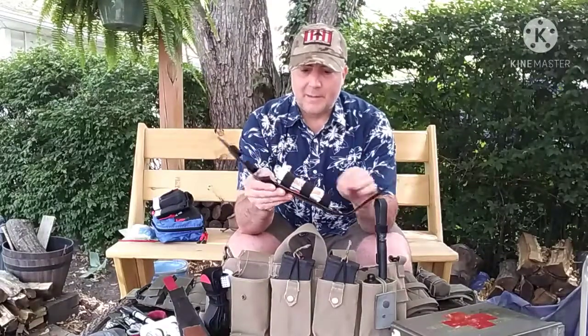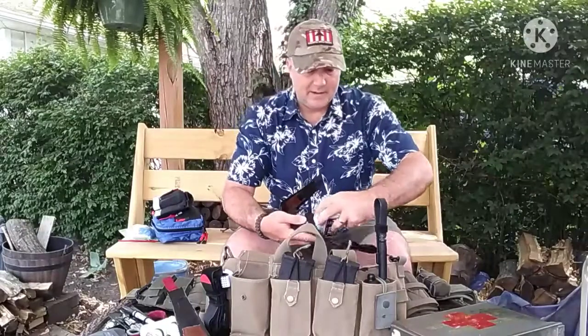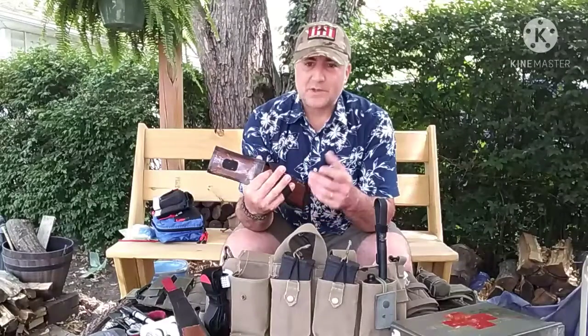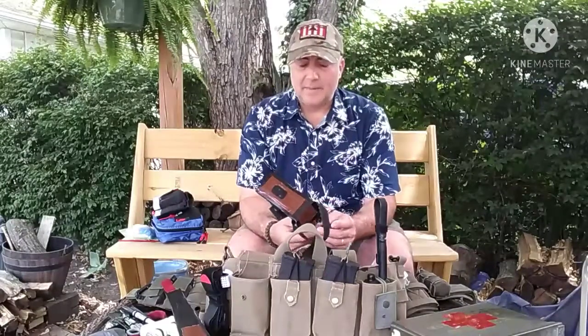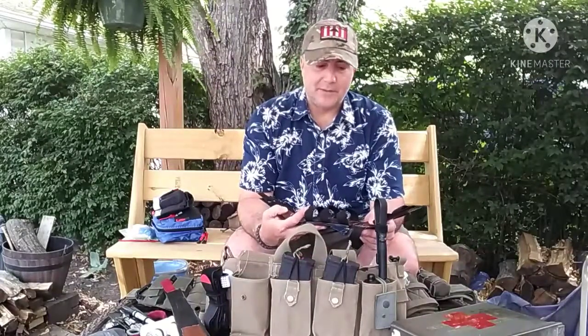But another thing I like about these a lot is you pop everything out of here. Again, there's not a lot in there. It's just the basics. That's it. Your boo-boo kit for your general boo-boos. Cuts and nicks on your fingers, arms, just those minor things. That's the kind of stuff that's going to be carried in your boo-boo pouch. Cargo pockets, chest pocket of a shirt. Things where you're providing that quick little aid to yourself so that they don't become a bigger issue down the road.